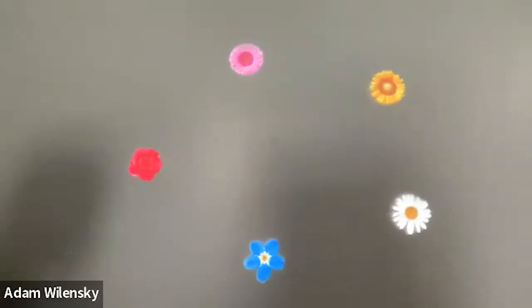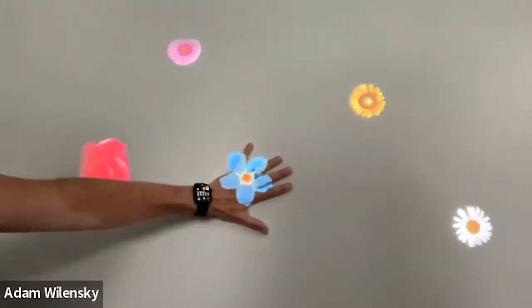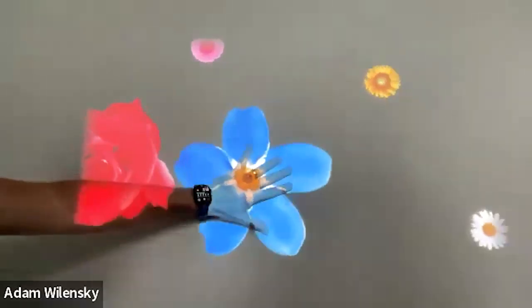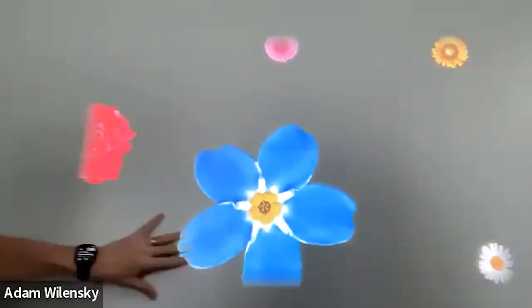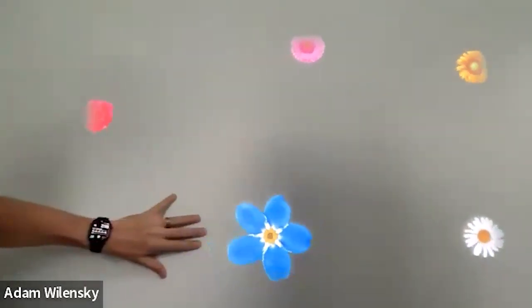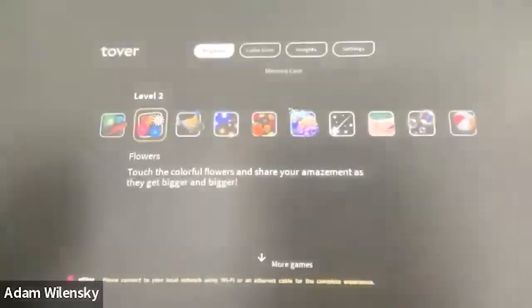Flowers is a very, very straightforward game. And really, we should classify it as a program because it doesn't have a formal start or stop period. All I'm doing here is placing my hand on the canvas, and that flower is going to expand with my touch. It's a very practical way of deploying different resident experiences throughout the day and then the evening.